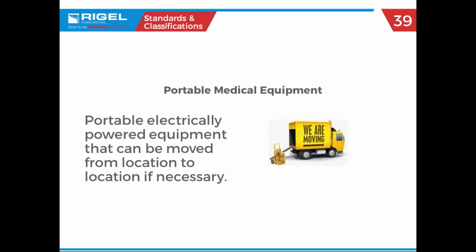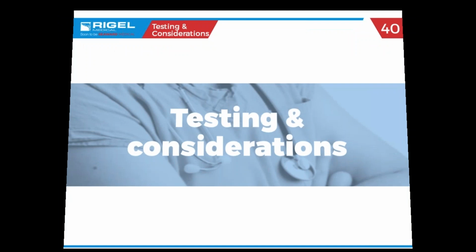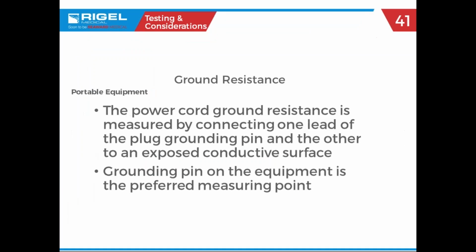Portable equipment, more portable equipment certainly in the hospital than anything else. This is stuff that gets moved around on location to location, room to room, OR to OR, can be moved from location to location as necessary. And again, probably here is where we do most of our testing. So when we start jumping into this now, we're going to be looking primarily at the specifications for NFPA 99. We're going to do some comparisons to the other standards just to kind of give you a feeling as to what the differences are and maybe the thought process behind those differences.